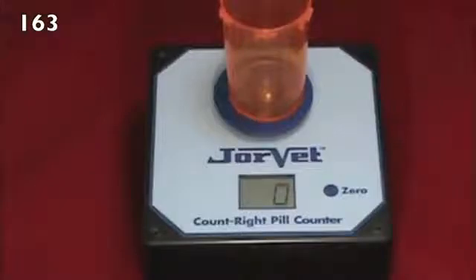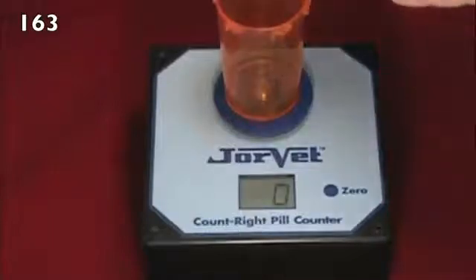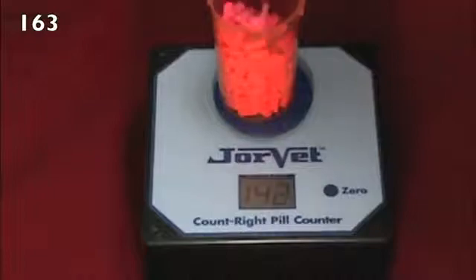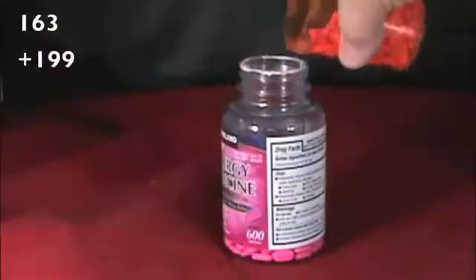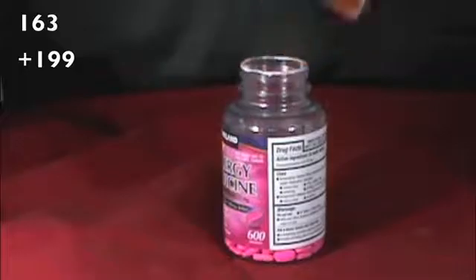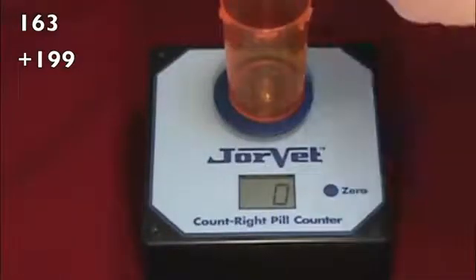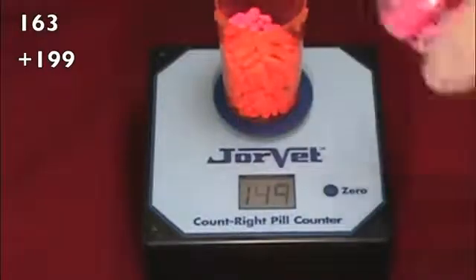Do not press the zero button or attempt to add five pills. You can now pour a large number of pills into the vial, up to one hundred and ninety-nine at a time, stopping when you reach 150 to 199 as before. Repeat these last steps until you have counted all the pills, then simply add up all the previous counts to get the total number of pills in the stock container.